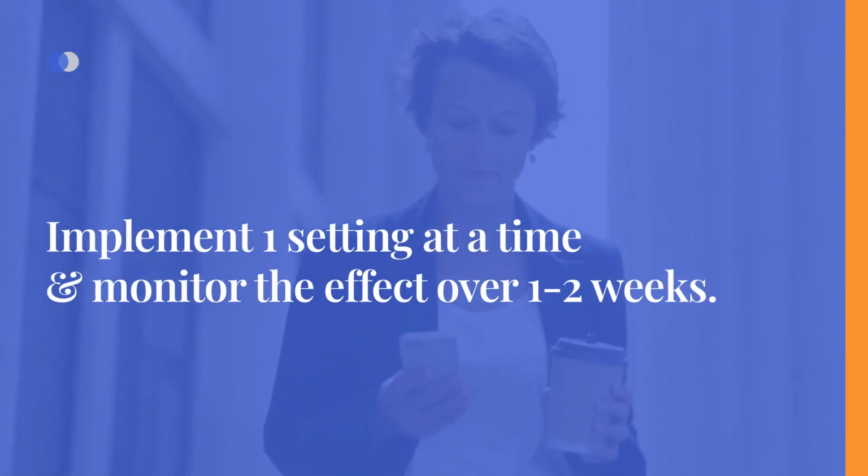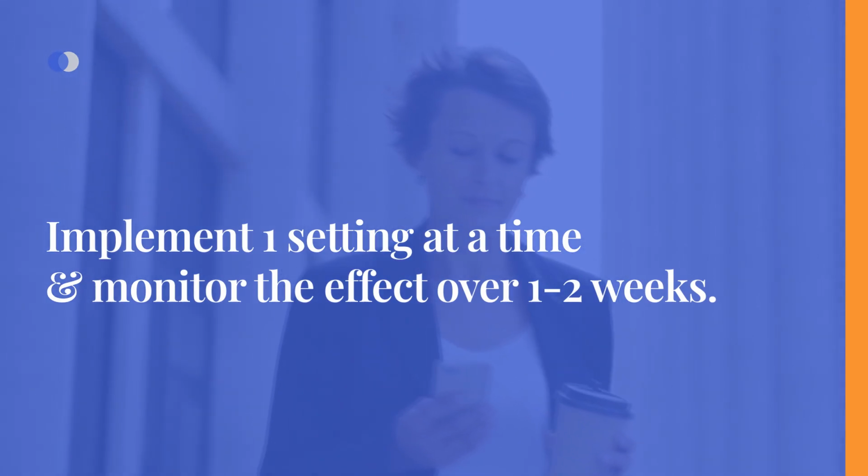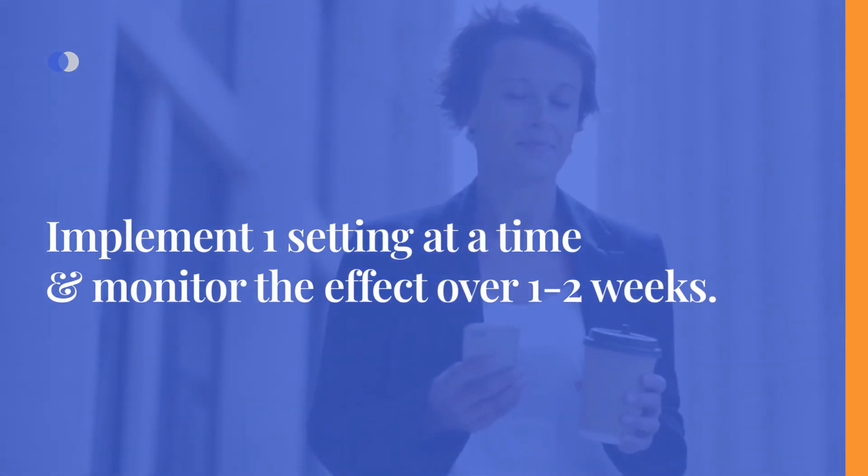When making changes, it is recommended to modify one setting at a time. After implementing a change, closely monitor the effects over a period of 1 to 2 weeks. It is possible that your initial adjustment may not yield the desired results, in which case you can explore alternative options and make further adjustments accordingly. The key is to iterate and fine-tune your settings based on the feedback provided by your Nightscout reports, ensuring optimal performance of your loop system.